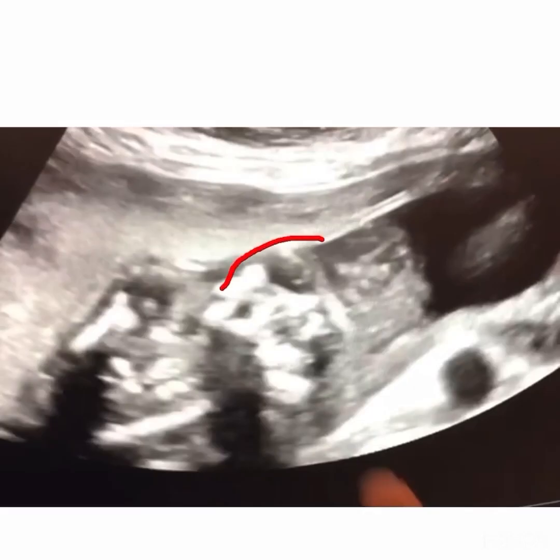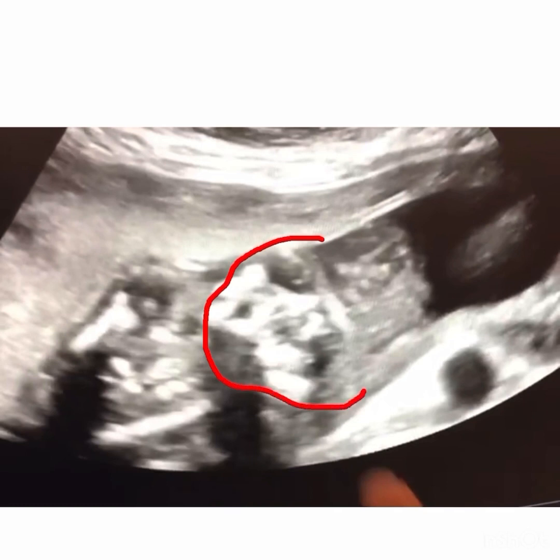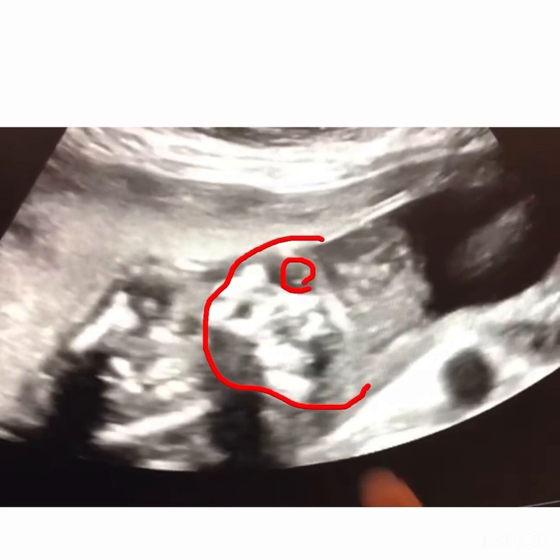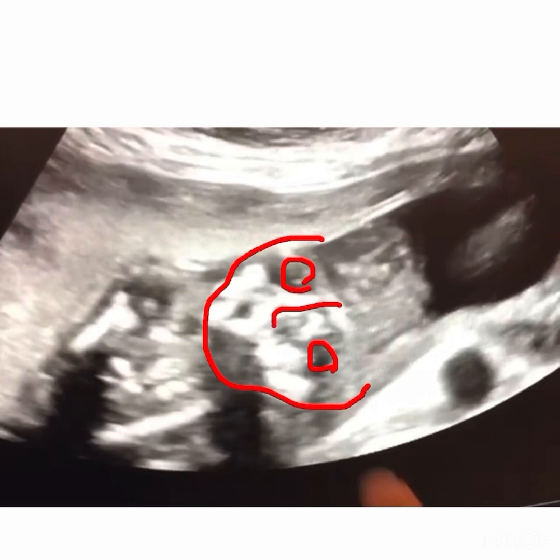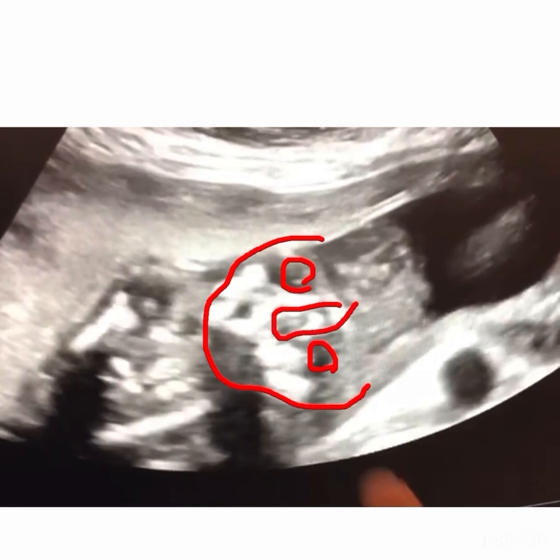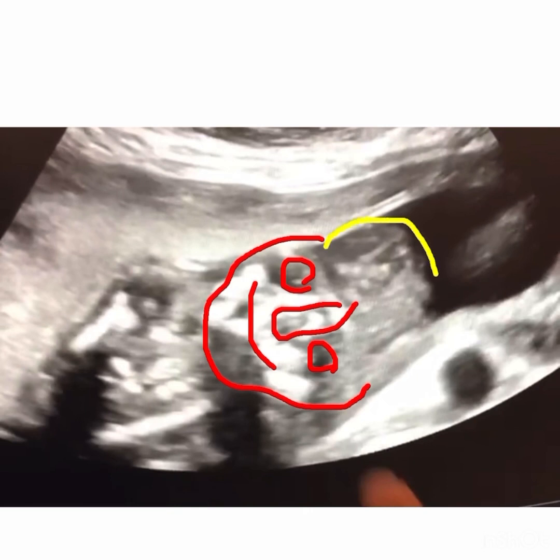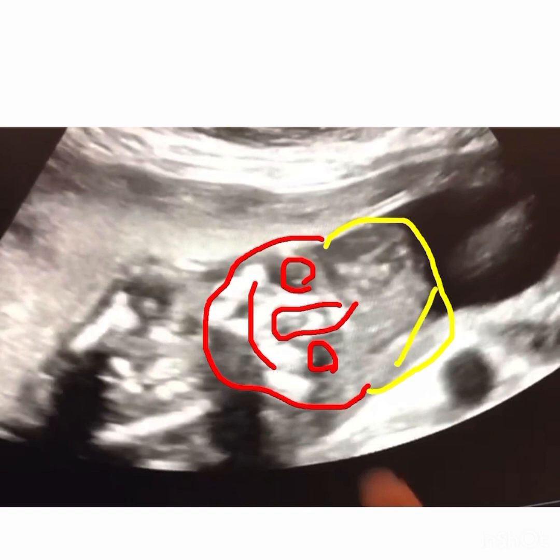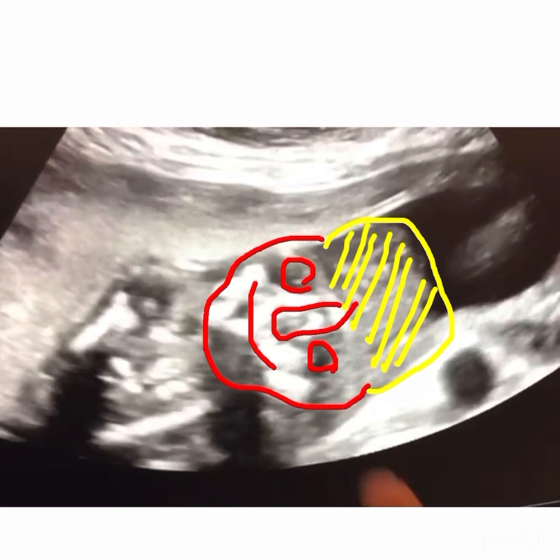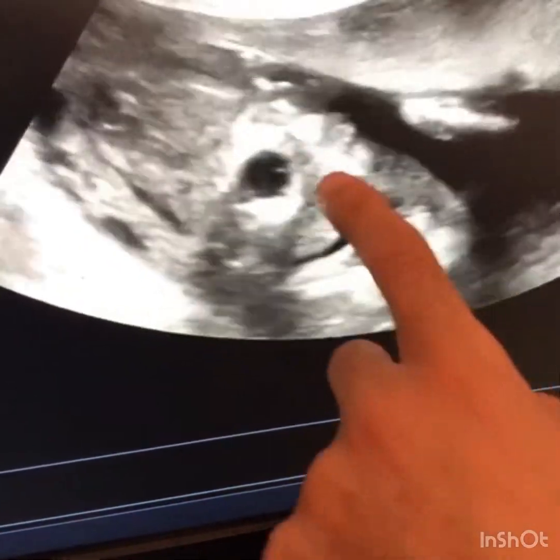In this picture, we can see the face of the fetus clearly. The eyes are here, and we can also see the nose and other parts of the face. In exencephaly, we can see the brain tissue above the eyes, which is its difference from anencephaly, but it has no calvarium. The fetus here is 18 weeks of gestational age.